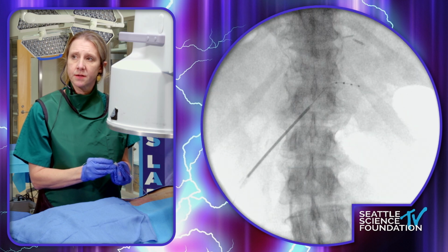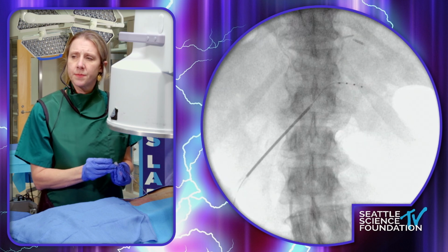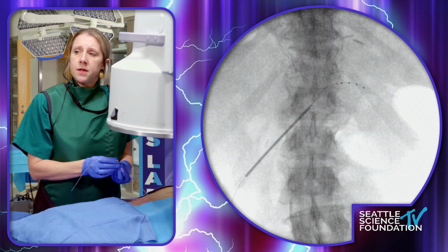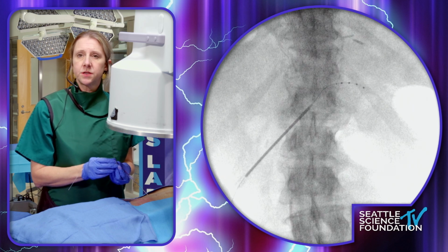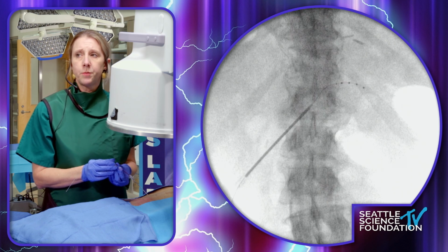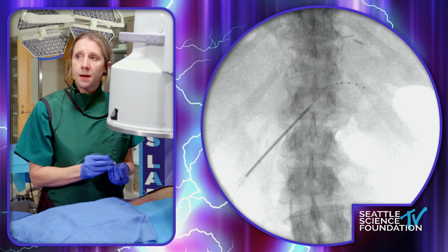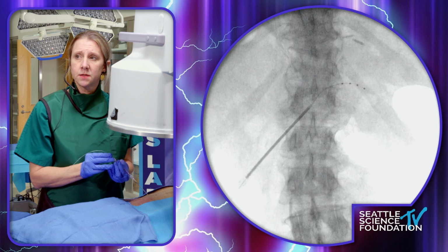So I want to stop there, actually stop here. Okay, now it's more clear. So on my image, you can see the 4 contacts, which are all exactly the same in size. And then you see a small little radio opaque marker that is on the end of the introducer sheath. So you know where the end of your introducer sheath is as you are performing the procedure. I'm going to bring the introducer sheath, leaving the lead where it is, all the way back to the needle.